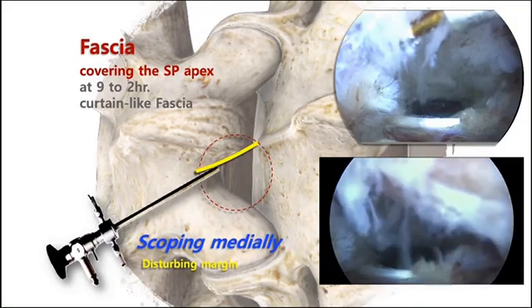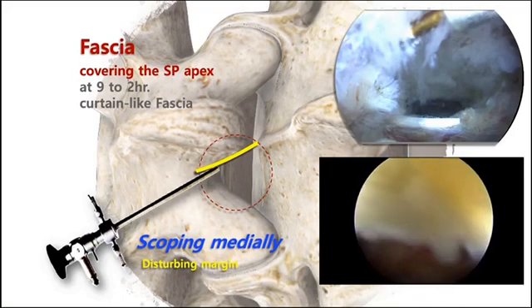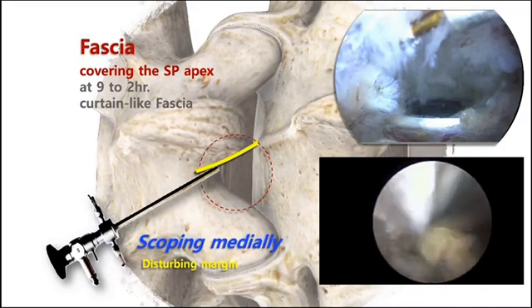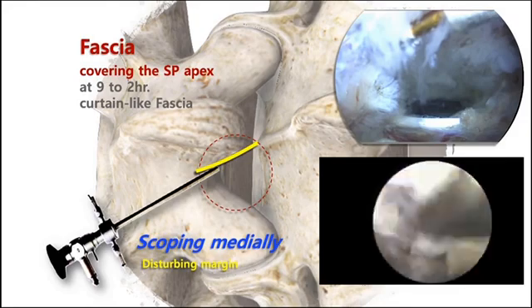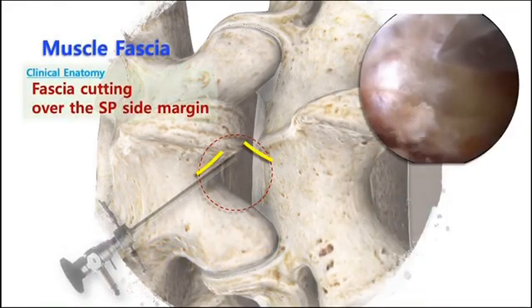Then you should try to remove the rugged and floppy fascia disturbing your view. It can take several minutes and you can lose your smooth procedure steps. The structure hiding your view to the SP base is subcutaneous fascia.